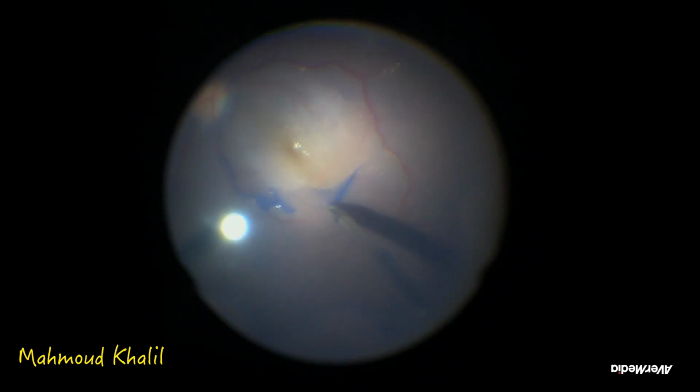As we see, we remove the ILM in a circular manner and remove as much as possible of this ILM. This helps to prevent PVR from creeping over the macula and causing an epiretinal membrane.